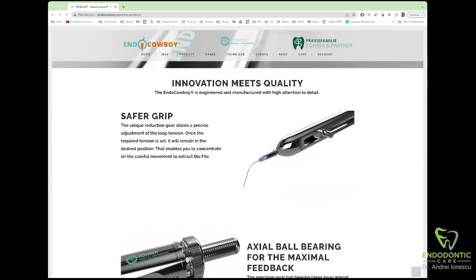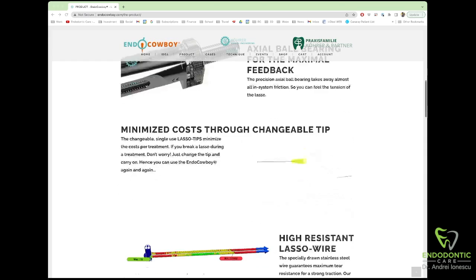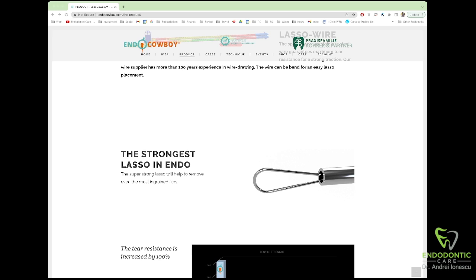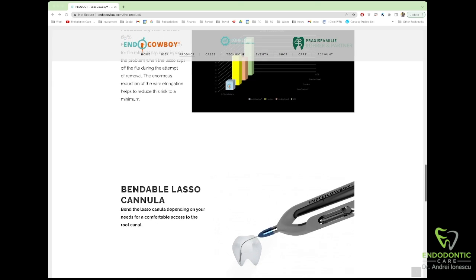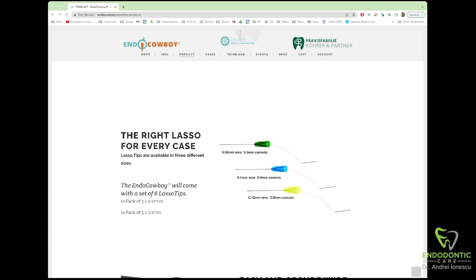The EndoCowboy is a micro lasso tool designed to allow you to grab onto files located deep within the root canal. It has a disposable tip and the tips come in three different sizes: 0.08 millimeters, 0.1 millimeters, and 0.12 millimeter wire.